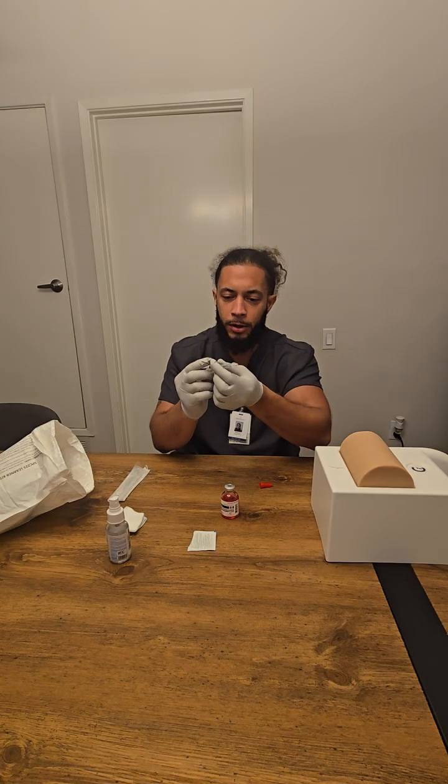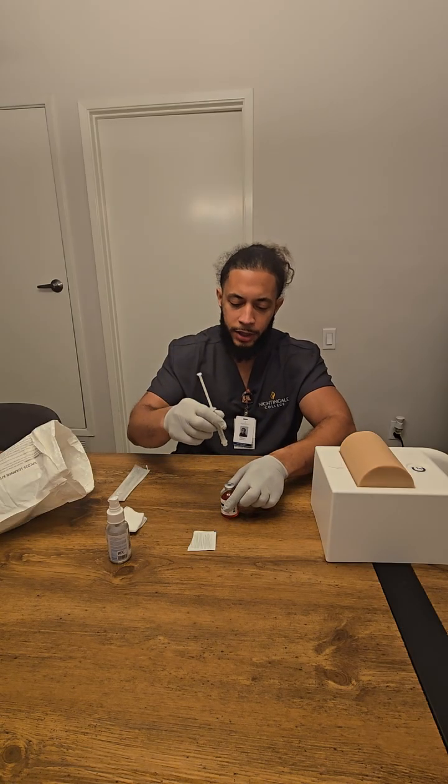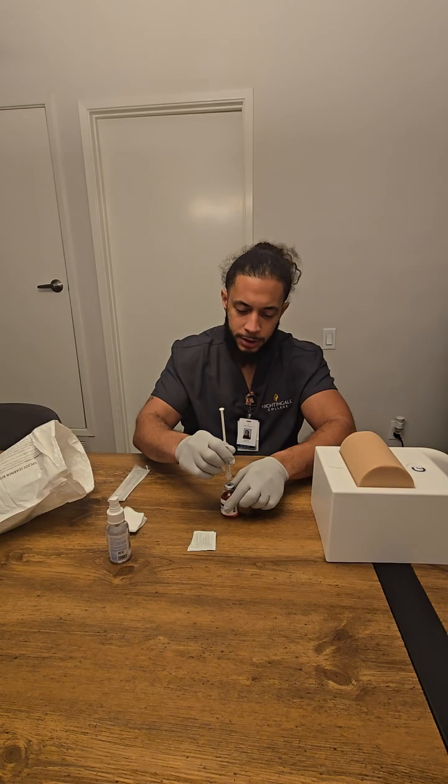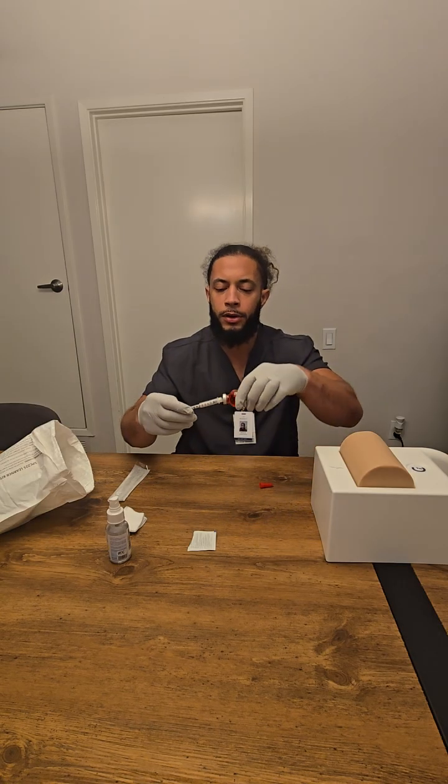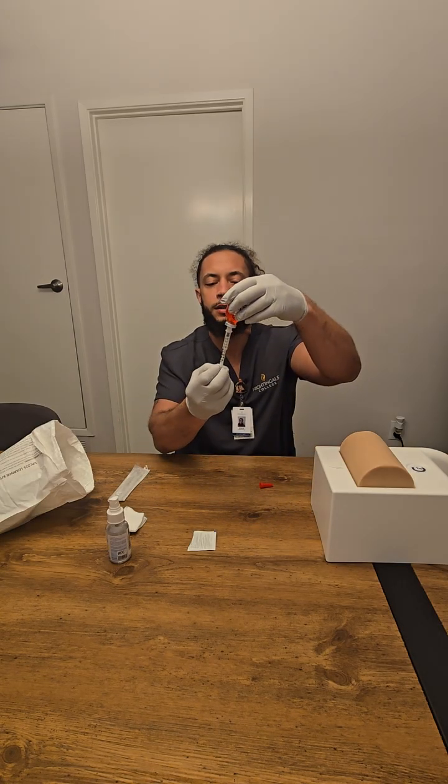Now I've drawn up 1 mL of air and I'm gonna insert it into my medication and put the air in, then invert the meds.